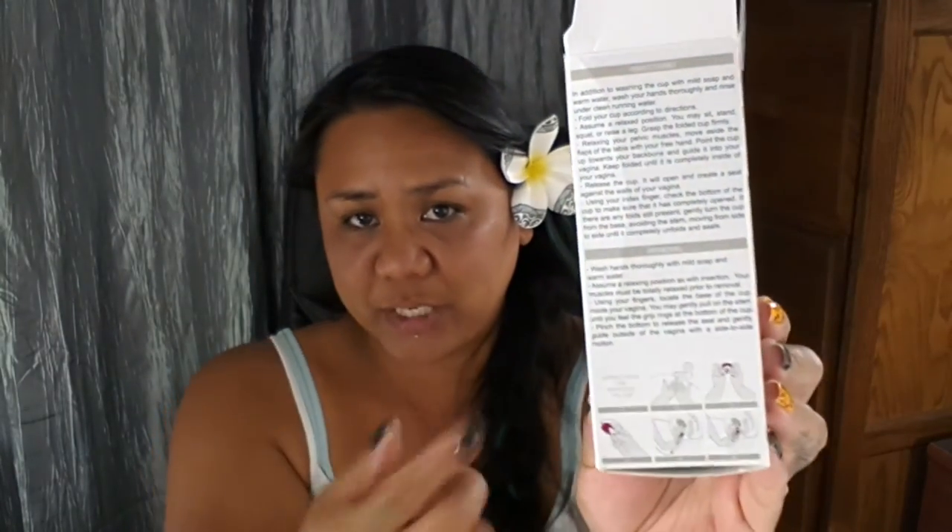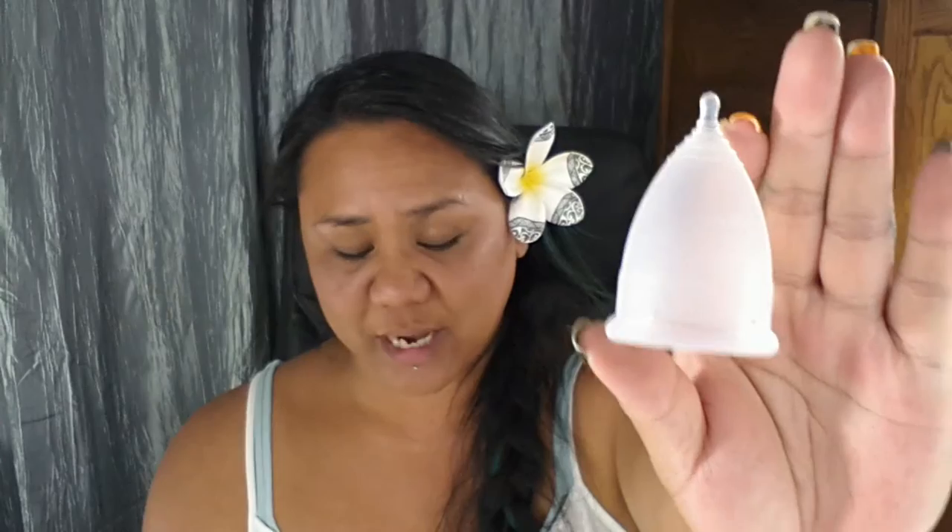The only instructions or directions listed are on the box itself, which I already did a turnaround of. If I was a first-time user, I would probably have to look up more instructions on the internet or YouTube. Here is the Green Cup of Maine — it kind of reminds me of the Diva Cup, just the way that it's finished off. It's frosted, so it's not clear.